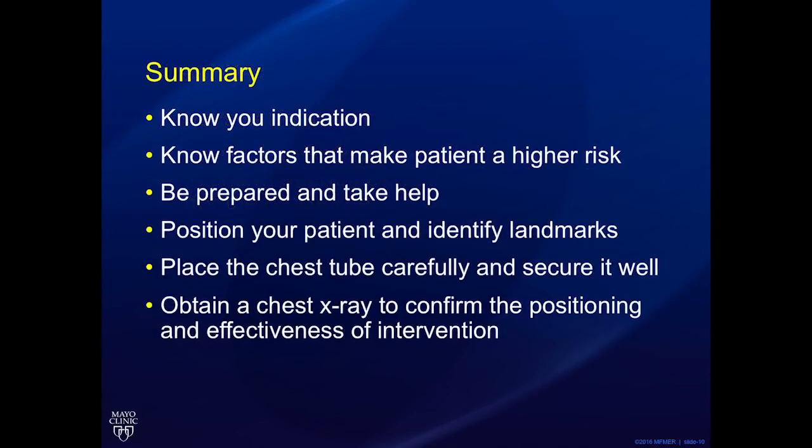In summary, it is important to know your indication for chest tube placement. Know any factors that make your patient higher risk: bleeding, previous surgery, and if they have an elevated hemidiaphragm. Be prepared and take help. Position your patient carefully and identify your landmarks. Place the chest tube carefully and secure it well. And finally, always obtain a chest X-ray to confirm the placement and the effectiveness of intervention.